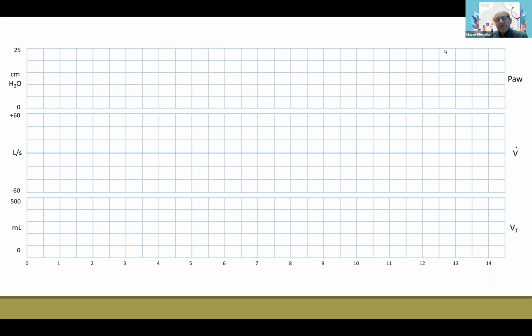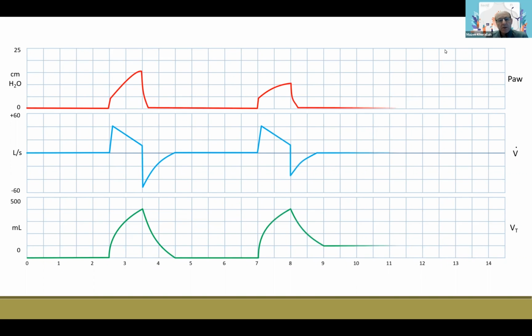And I'm going to identify first how you detect it by looking at the scalars. The patient, as you see here, is on volume control mode of ventilation. You can see how the pressure is increasing in inspiration, so it's not pressure control, even though the flow waveform is decelerating. Of course you can do volume control with a decelerating flow wave. And you can see the tidal volume of 400 as a result of 15 centimeters of inspiratory pressure, and the flow goes up to 40 liters and then decelerates.